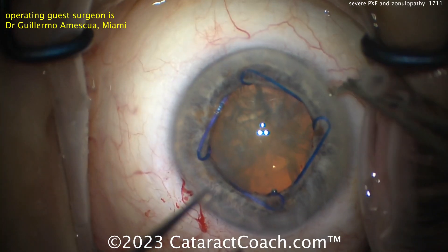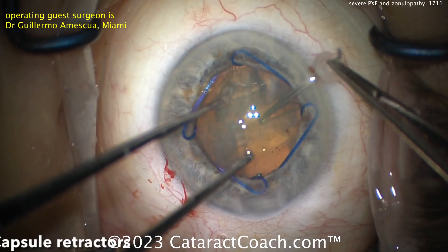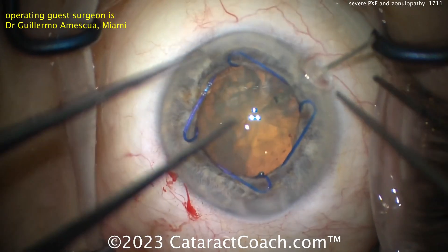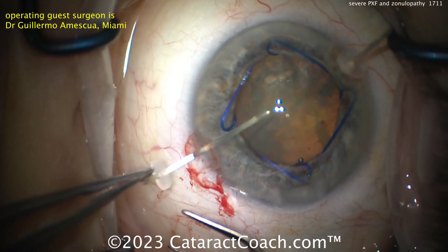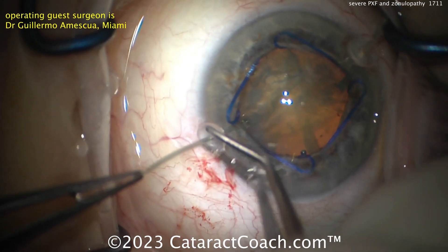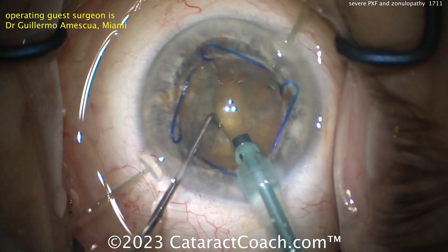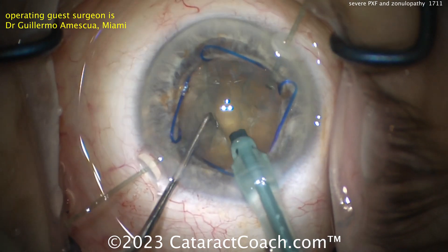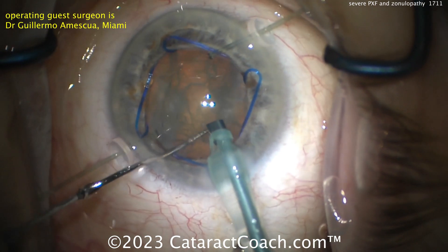Our guest surgeon here, Dr. Guillermo Amesqua from Bascom Palmer, Miami — he's a fantastic surgeon. He's going to put capsule retractors in to hold the capsule as you remove the nucleus. Notice how the capsule retractors are a little bit different than iris retractors: the ends are more likely to give good broad support, they're a little bit longer, and they're not likely to puncture through the anterior capsular rim.